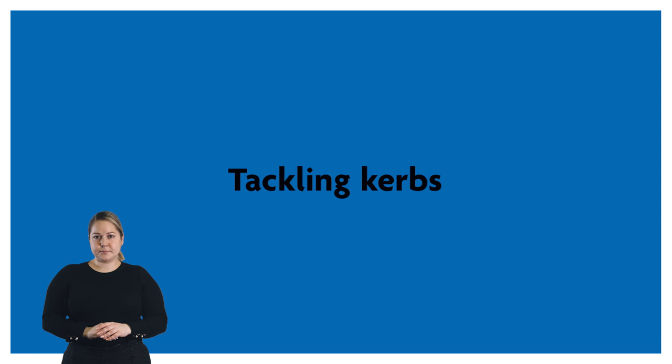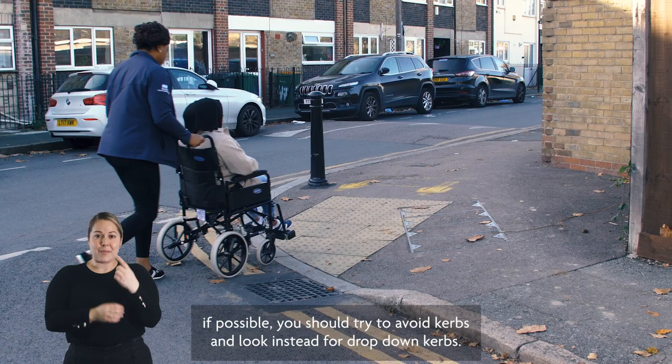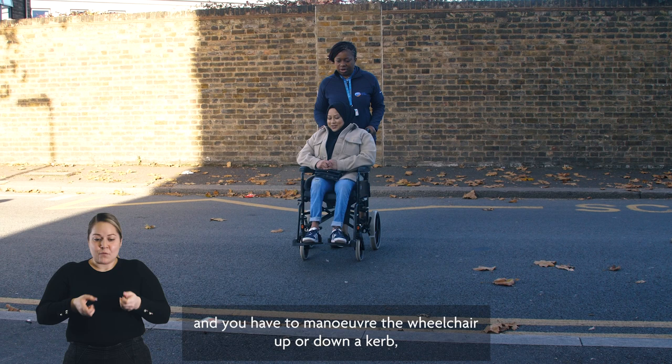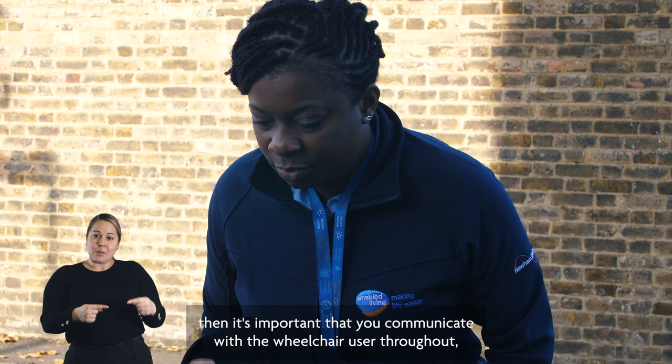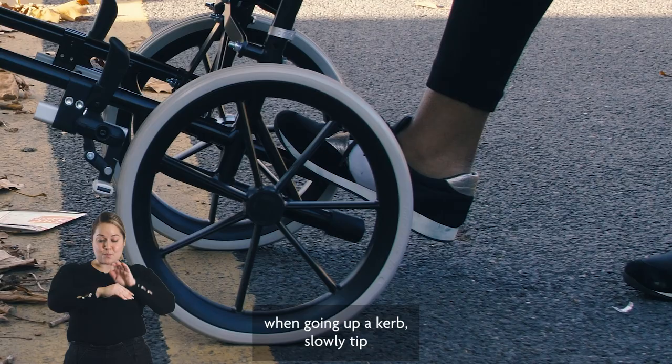When out and about, if possible you should try to avoid curbs and look instead for drop-down curbs. If a drop-down curb isn't available and you have to maneuver the wheelchair up or down a curb, it's important that you communicate with the wheelchair user throughout, letting them know what you are doing and what to expect.